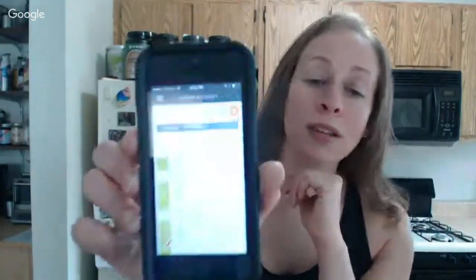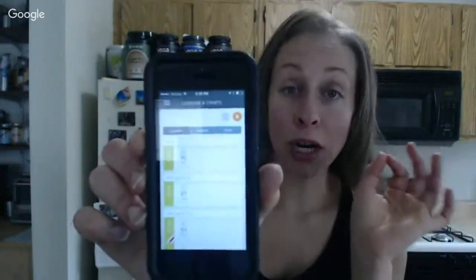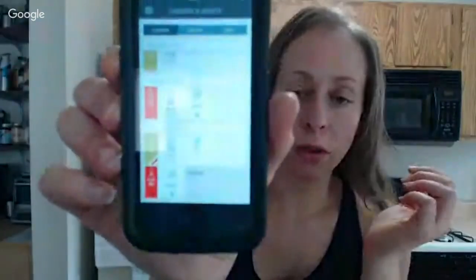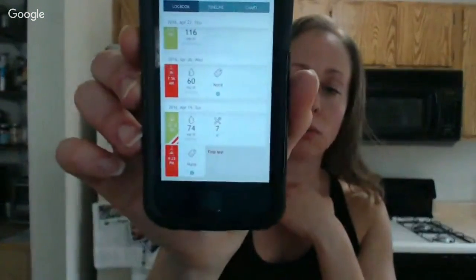It shows you each of your readings, and you can put a note in every reading if you want to. For example, the first time I took a reading, I wanted to check it out, so it says note. I put a note that said first test, first time I've tested on this. And the next one, I put that I had 7 grams of carbs to treat that 74 blood sugar before I went to bed. You can literally note everything that you want in your phone.